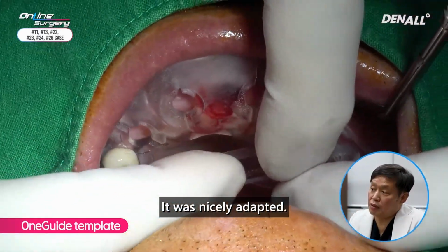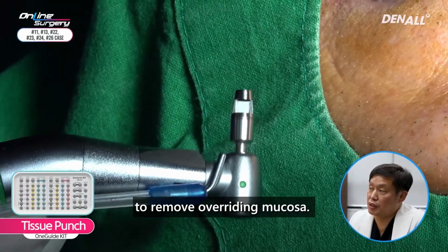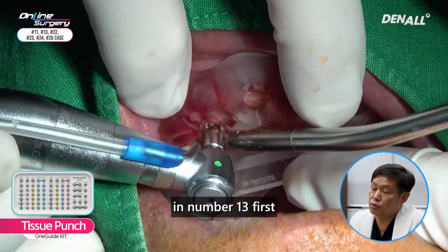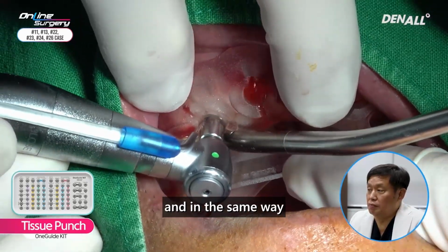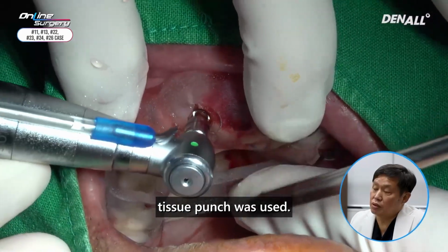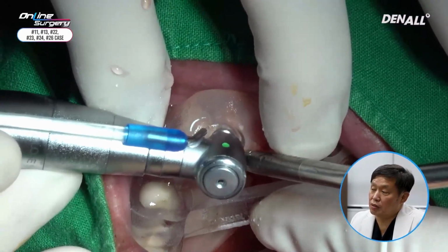It was nicely adapted. First, a tissue punch was used to remove overriding mucosa. Overriding mucosa was removed in number 13 first, and in the same way, in number 11, a tissue punch was used to remove the overriding mucosa.